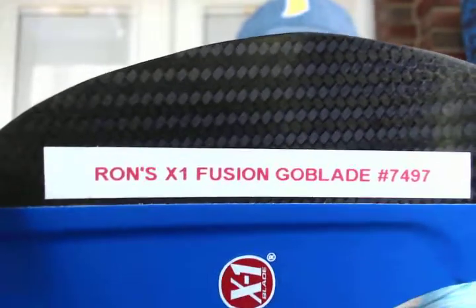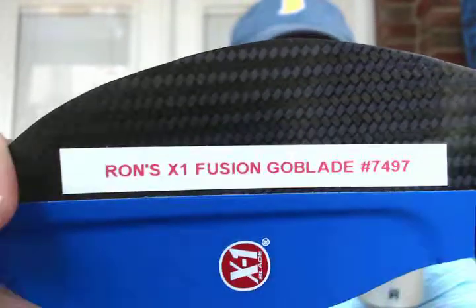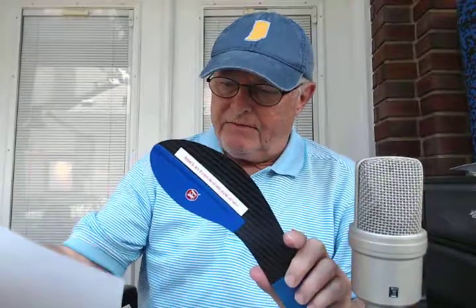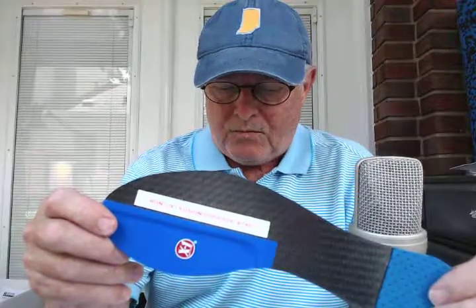Hey, it's ClydeIndianaBrace.com. This is Ron's X1 Fusion GoBlade No. 7497. Ron is from Vienna, Virginia, and he just fractured his first middle phalanx on his great toe. He's got a walker boot, and he's tired of wearing the walker boot.